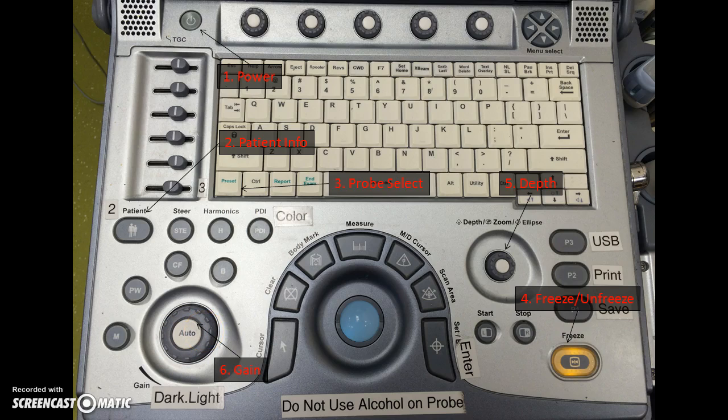And so I think that in terms of how do I use the ultrasound, those are the 6 buttons on an otherwise pretty button heavy machine, or I guess you could say that there's a lot of cognitive load when you look at this as an entire machine, but looking at these 6 buttons are really all that a learner would need to optimally use the ultrasound.